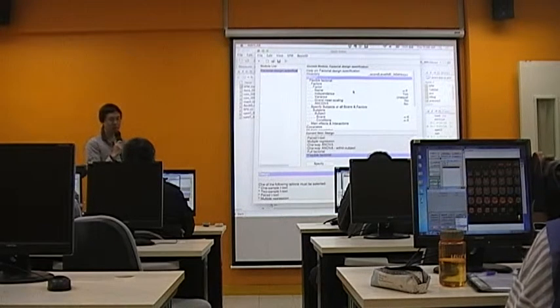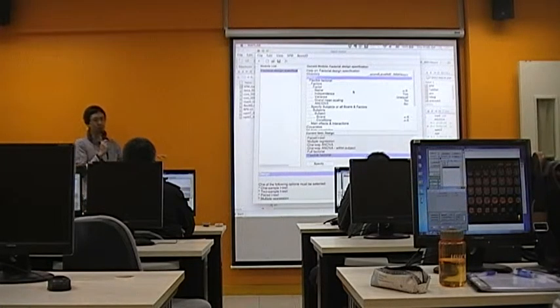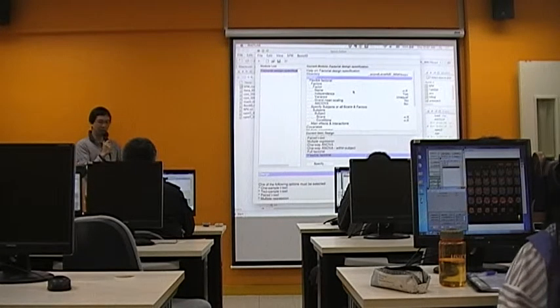For the clinical subjects, if they are more heterogeneous, then you should expect their performance would not have equal variance within the group. So in this case, you could define the equal variance assumption to uphold or not.